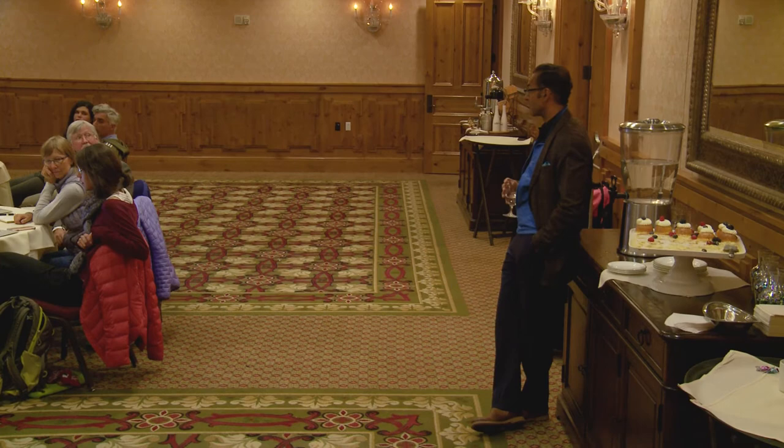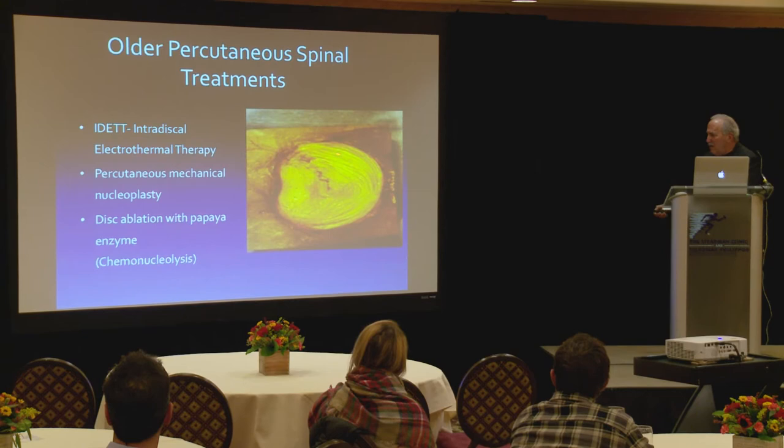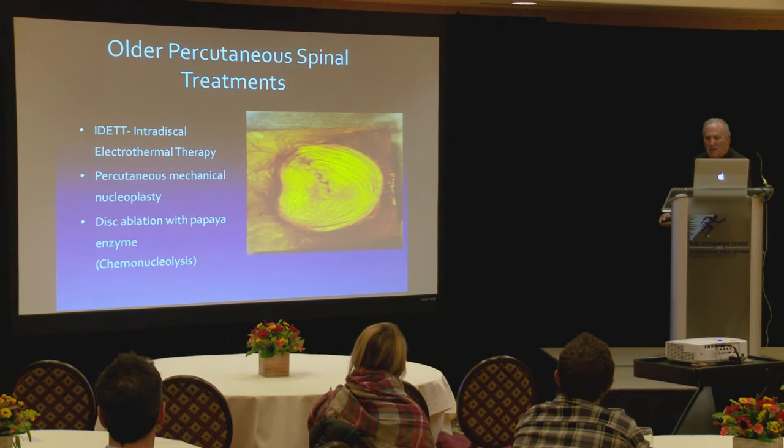So there are older techniques that you'll still see around. People have had IDET, intradiscal electrothermal therapy, where you take a catheter and you wind it around the inside layers of a disc and you burn and cauterize the disc. It was a great idea when it was invented, but it doesn't work too well and it can create issues. Percutaneous mechanical nucleoplasty, you put a cannula percutaneously into the disc and try and suck out as much of the disc material as you can.